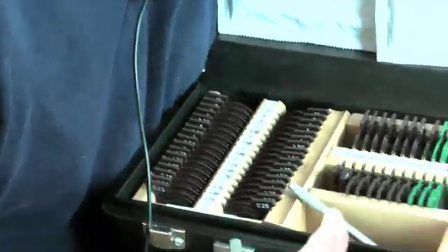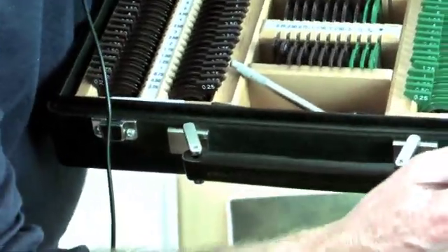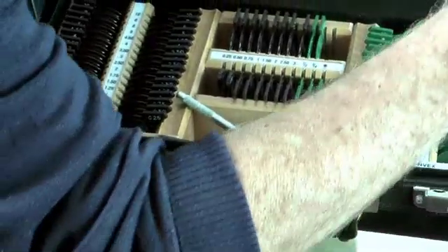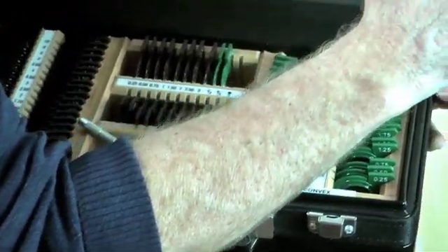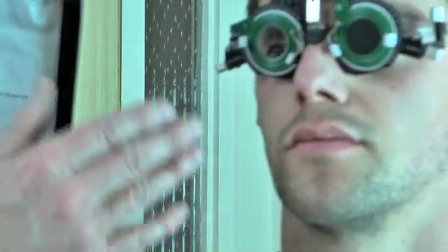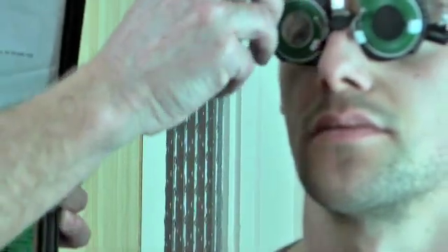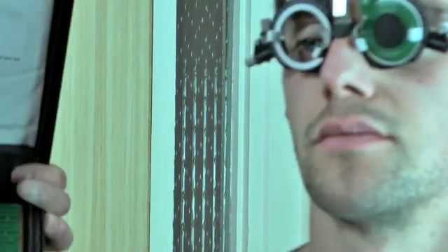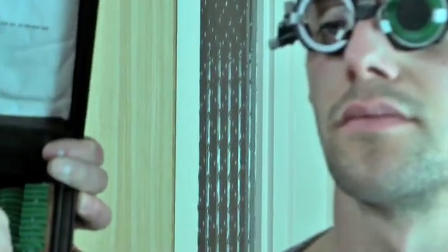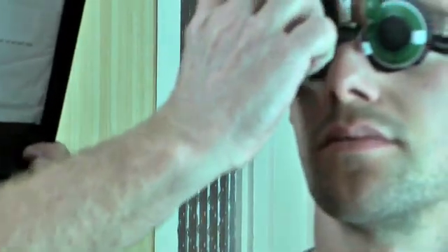Now let's assume that the patient is myopic, that he is actually short-sighted. In the case of myopia, when we put the plus 1 in there to relax the accommodation, the short-sighted person would say they don't like that, so we need to reduce it. So we can reduce it by putting a 0.50 in there first, just to start with. We'll take the plus 1 out and put a plus 0.50. We put that in the trial frame. So we've got a plus 0.50, we just reduce it down.